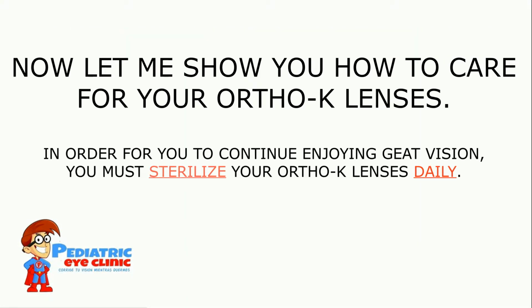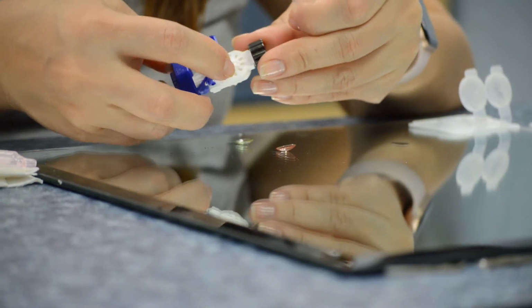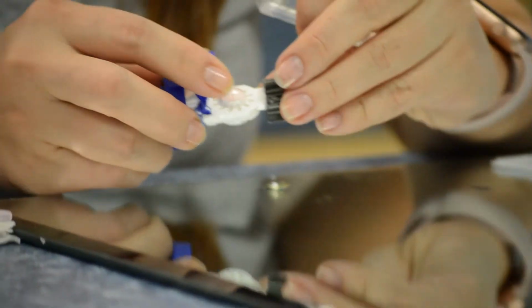Now, let me show you how to care for your Ortho-K lenses. In order for you to continue enjoying great vision, you must sterilize your Ortho-K lenses daily. Now that you've removed your Ortho-K lenses, grab your lens case and place the lenses inside.